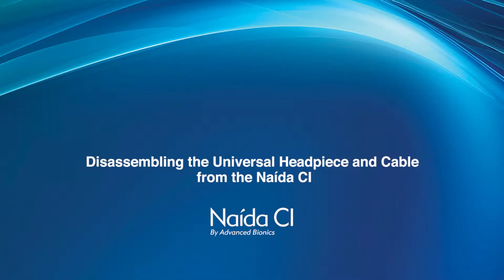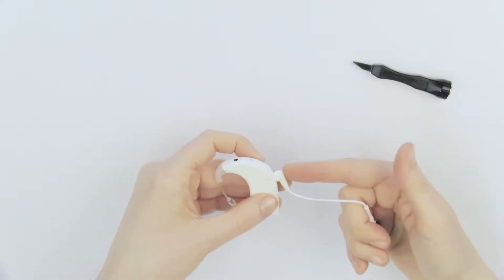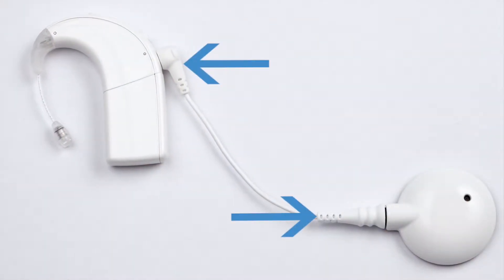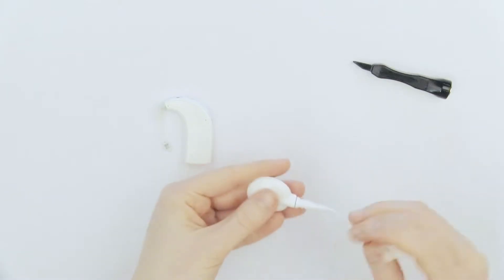Disassembling the universal headpiece and cable from the Naida CI. To begin, grip the cable from the strain relief on the processor side. The strain relief is the flexible portion located at the end of each cable. Pulling straight back firmly, remove the headpiece cable from the processor.